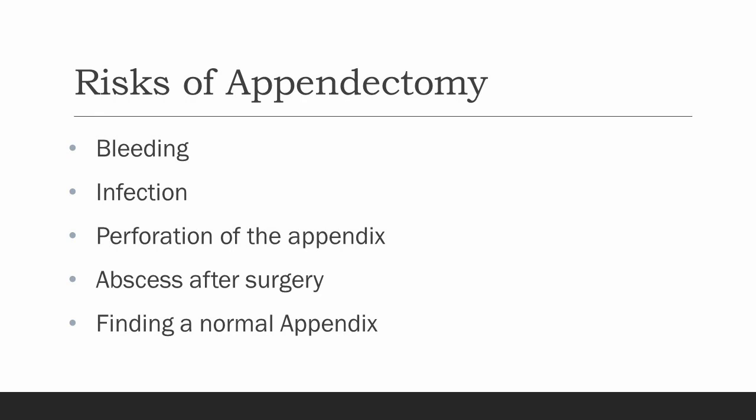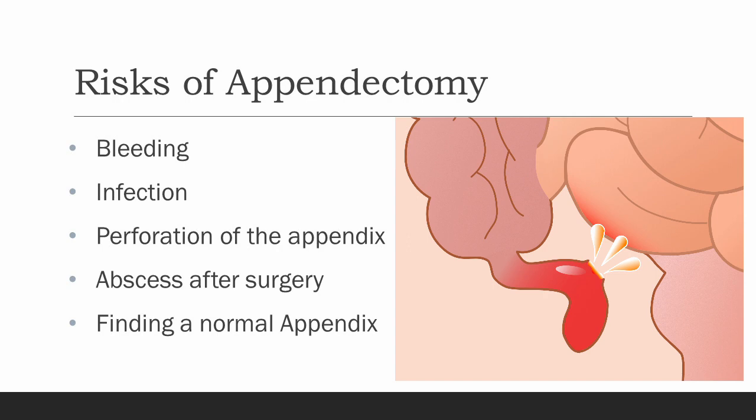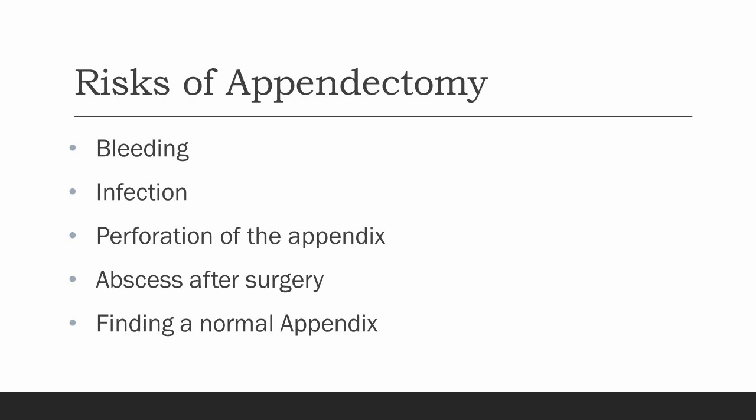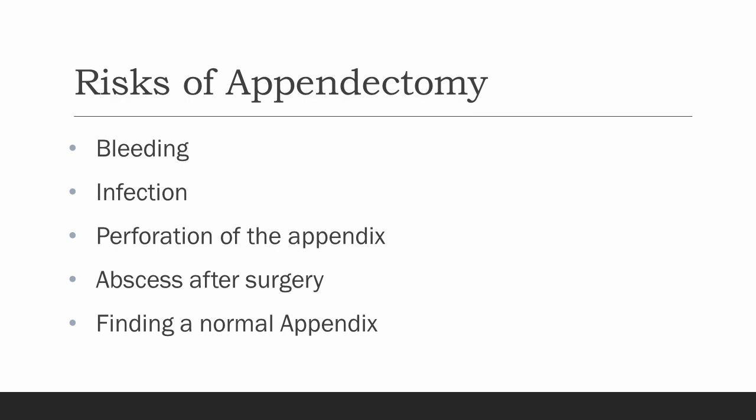It is not uncommon for us to get into the abdomen and find that the appendix has already formed an abscess or is already perforated, causing infection and inflammation of surrounding structures. We will often still attempt to remove the appendix if we think it can be done safely. In some cases, an appendix may perforate in the process of us removing it. If there is any concern for infection beyond the appendix, we may wash out the abdomen, leave a drain, or keep you on antibiotics for a short time following surgery.